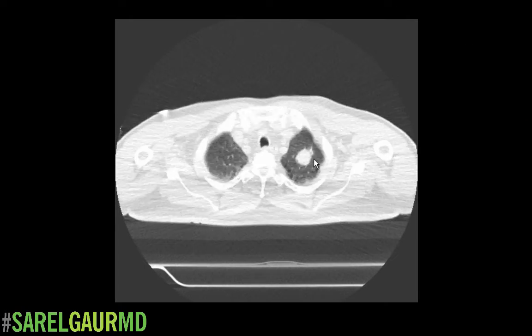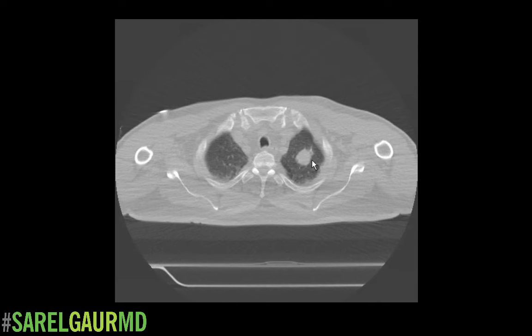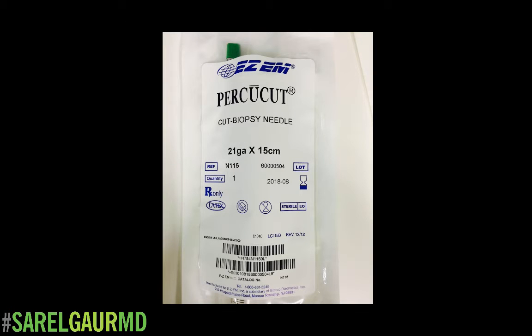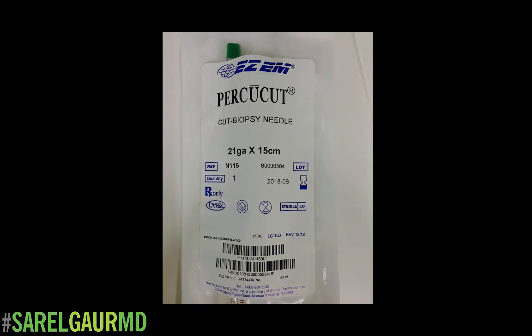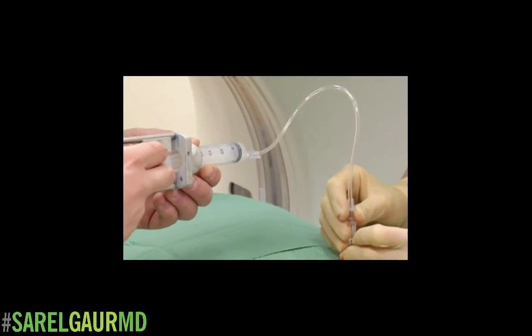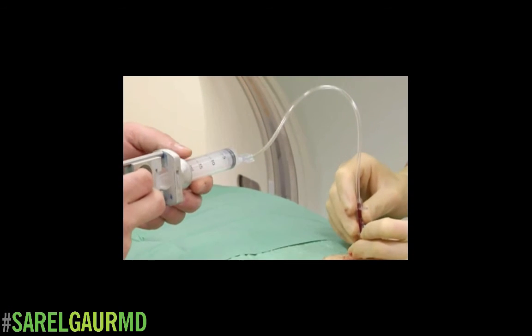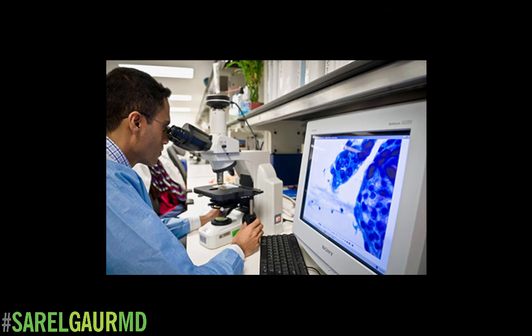Here you can see a scan where we've accessed the periphery of the nodule. From here, we're going to start obtaining our fine needle aspirates. Fine needle aspiration needles are very thin, very delicate needles. We take the stylet out and advance these FNA needles through that initial needle. Once we feel the tactile nature of the nodule, we start aspirating using a special technique — we hook up a syringe, apply negative pressure, and do a rocking to-and-fro motion, getting small aspirates of those cells. We then hand the needle and syringe directly to the cytotechnologist, who checks the sample under the microscope and ensures its adequacy for diagnosis.